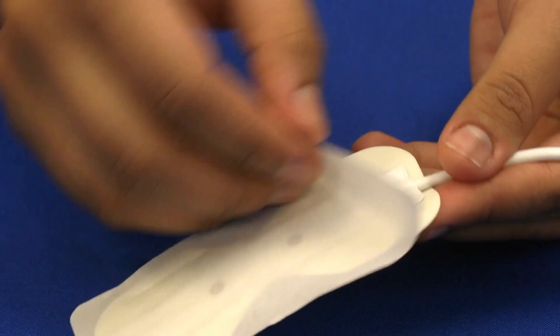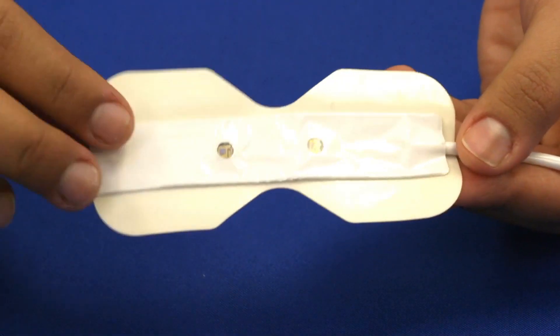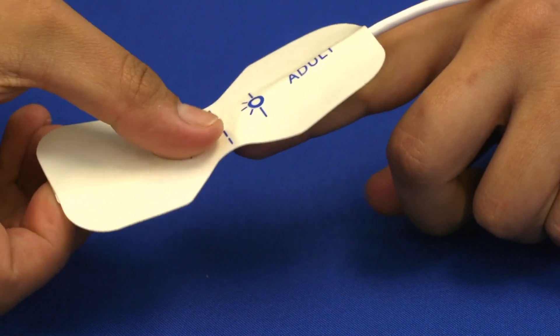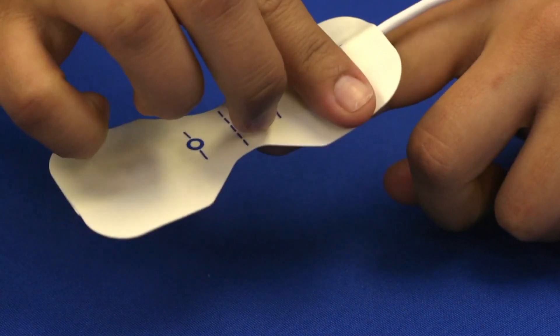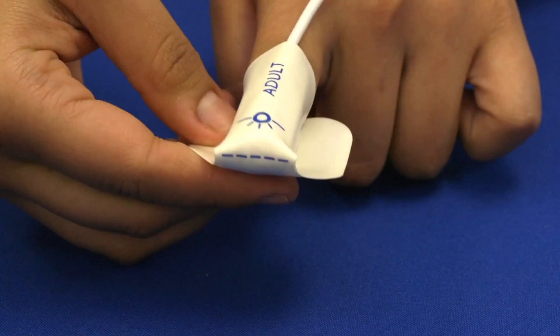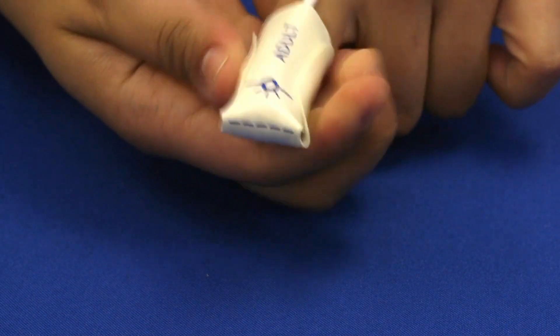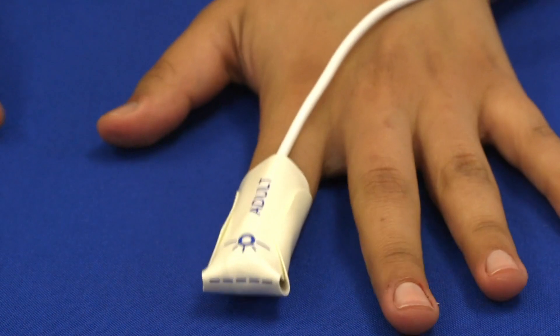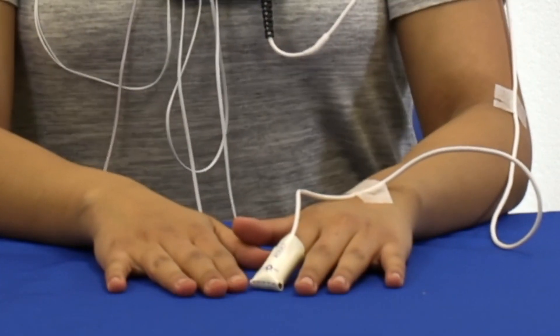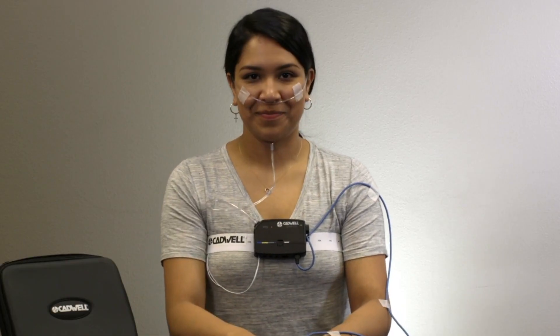Remove the paper covering the adhesive on the oximeter. Place the oximeter finger sensor on the index finger of either hand with the cable running up over the back of your hand. Wrap the sides down around your finger and fold the bottom side up and wrap the sides up to enclose your finger. If the cable hangs loosely, tape the oximeter cable to your shoulder and elbow. If there is no slack, tape it just to your hand.